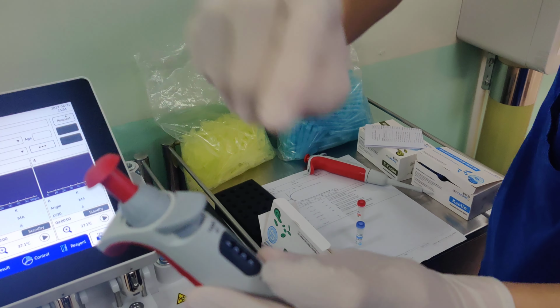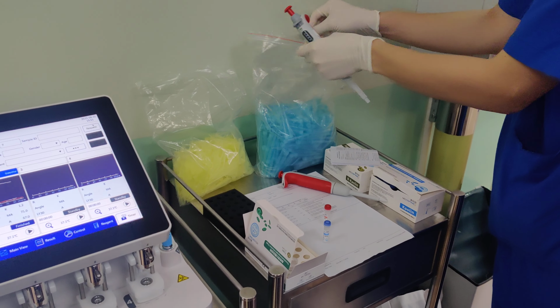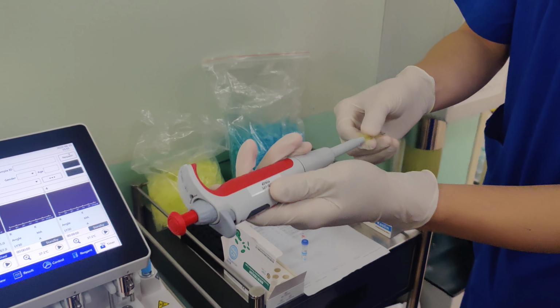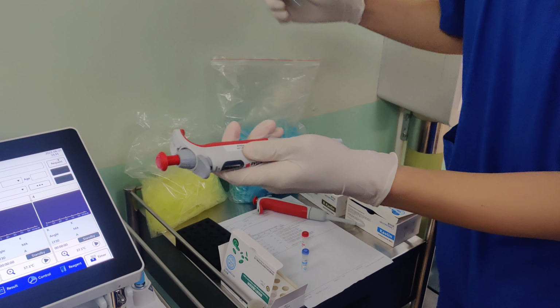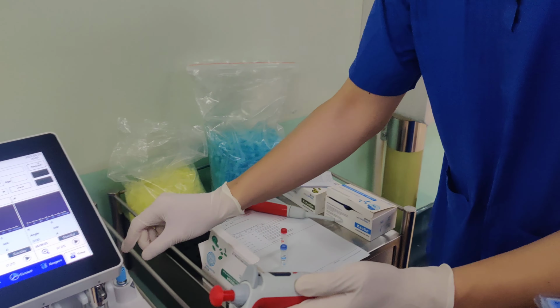Okay, 1 ml. And for this, we will need the bigger tips, because you can see, this one is for small volumes. It will not fit. So we will use the bigger ones. This one, same thing. Just push it up. Make sure it's secure.